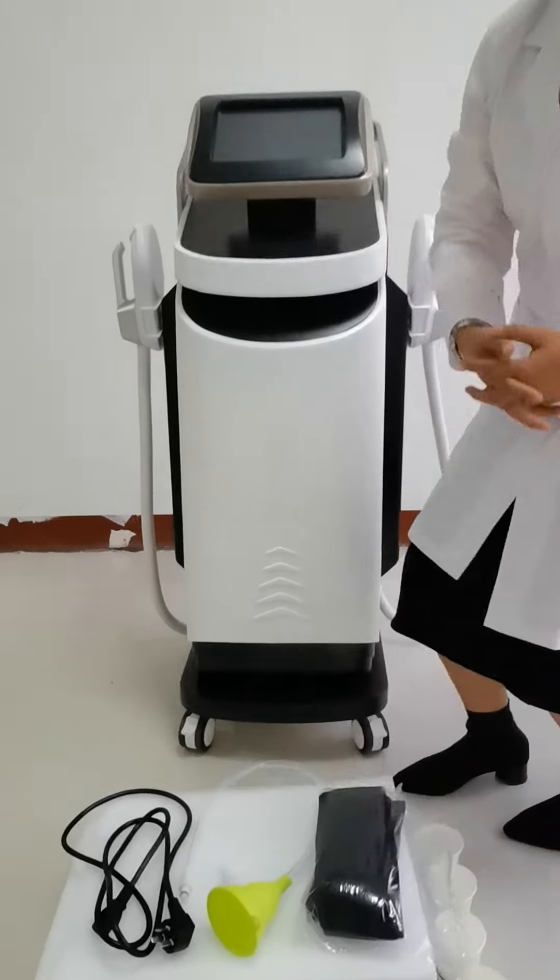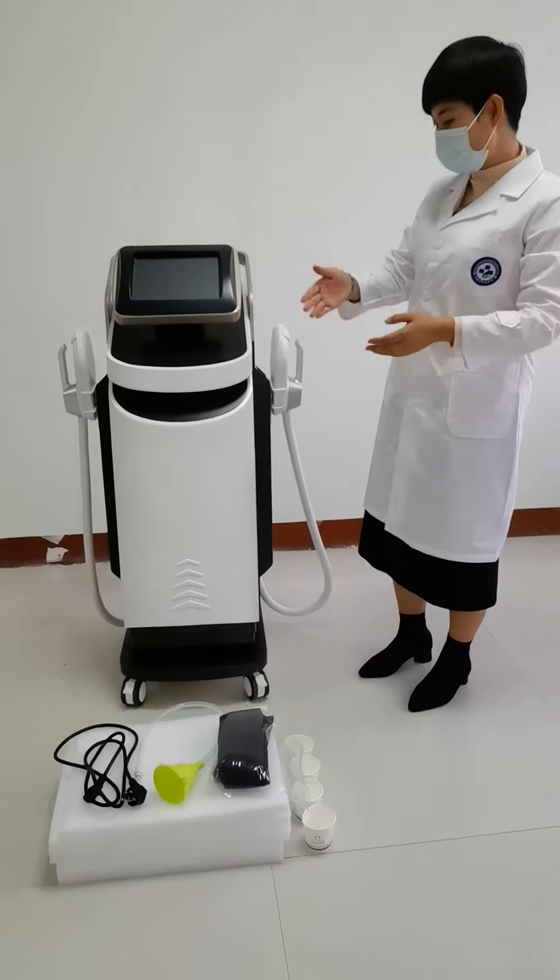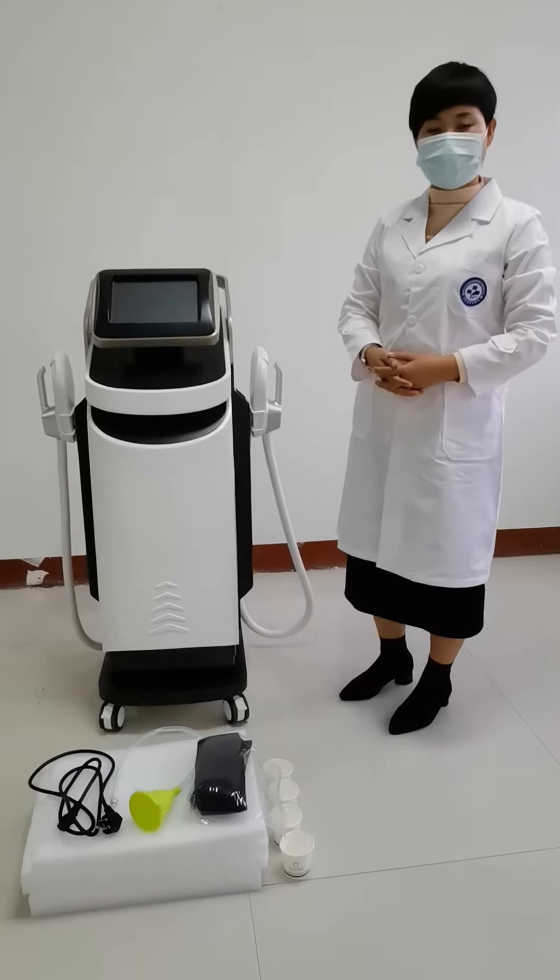When you receive the machine, first you need to take the host machine, two handles, and an accessory bag from the package.